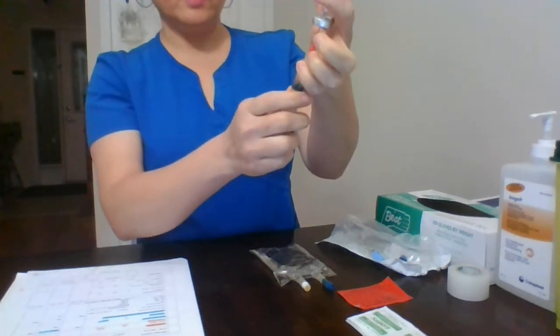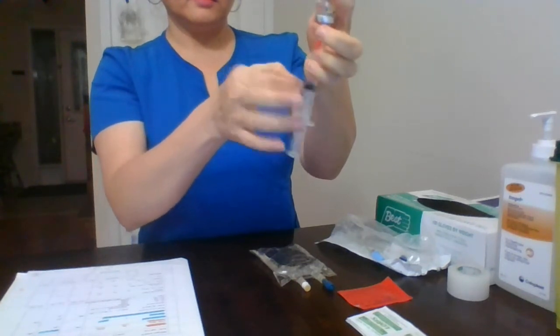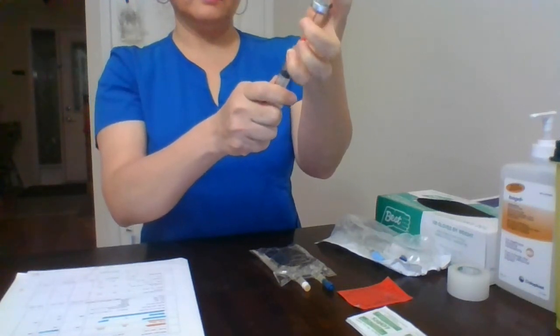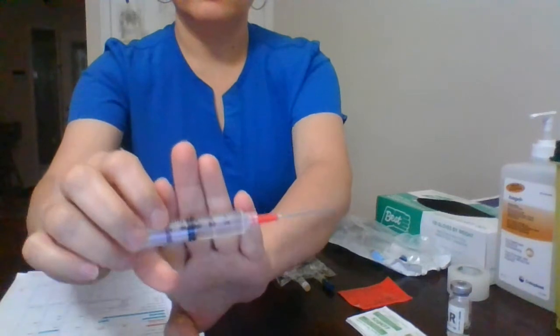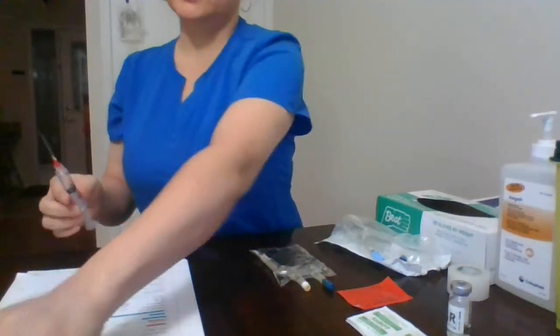I have no bubbles, so actually I see one bubble. I have 3 ml of our medication.